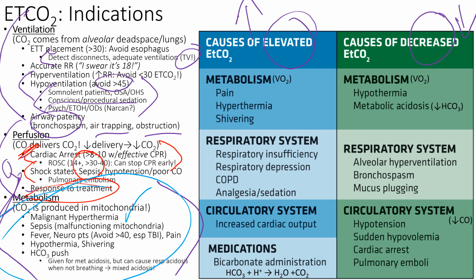But malignant hyperthermia, right? Like our gentleman over here, his CO2 is going to be climbing because his cells are firing off multiple times, right? The muscles are massively overworked, and they're producing a whole bunch of CO2. And yeah, he'll probably respond by breathing faster, but we'll be able to see the CO2 start peaking. Because if someone's breathing fast, they should have a low end tidal CO2. So why is his CO2 high? So that's part of the puzzle there, right?